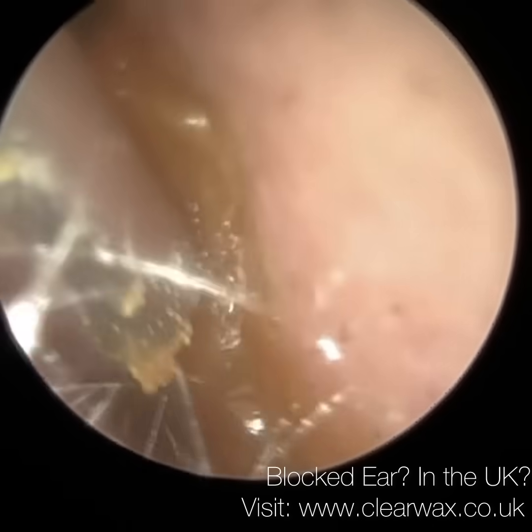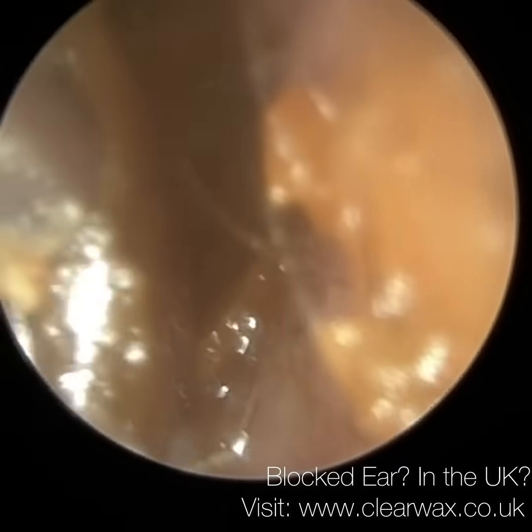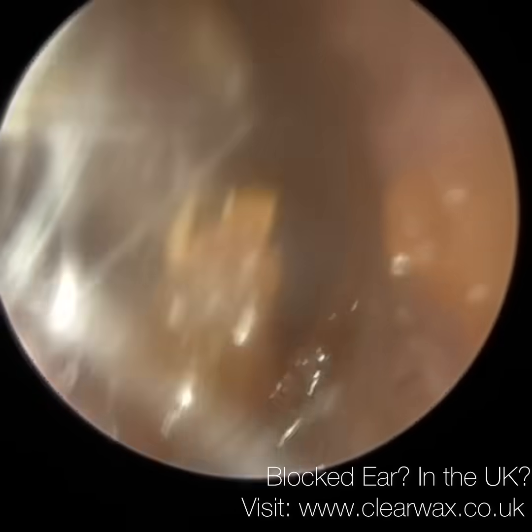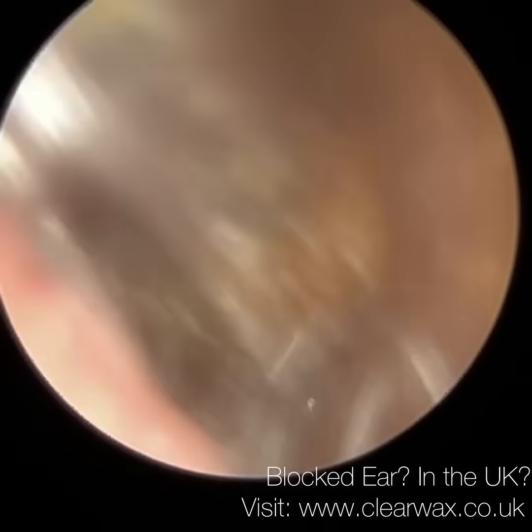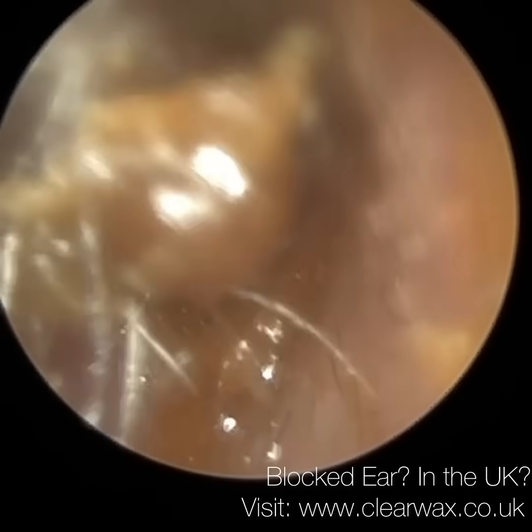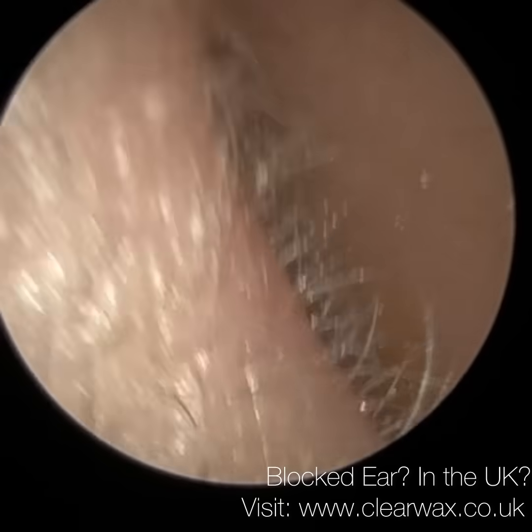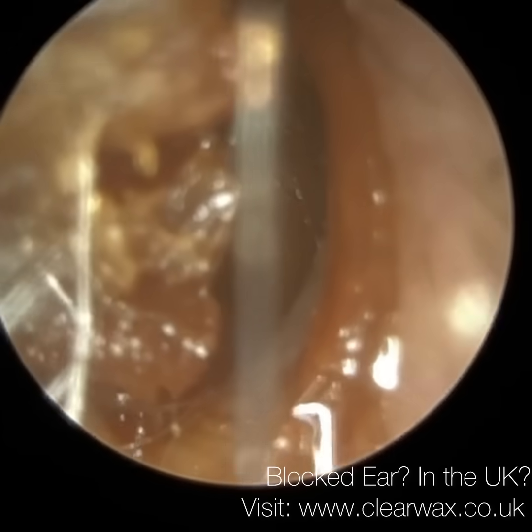And here we have a patient who attended with a fully blocked right ear. And as you can see, they've got quite a narrow opening to the ear canal. However, once you've entered the ear canal, it's quite large and cylindrical. Normally, our ear canals take on an oval shape, with the height being greater than the width. But in this patient, you'll see once I get all the wax out, they've got a very circular ear canal.